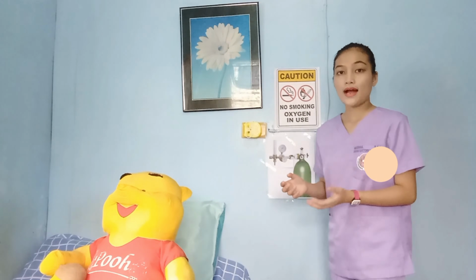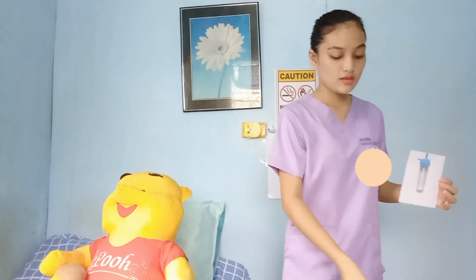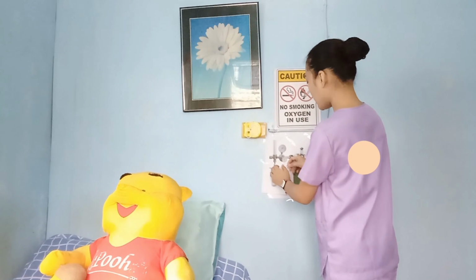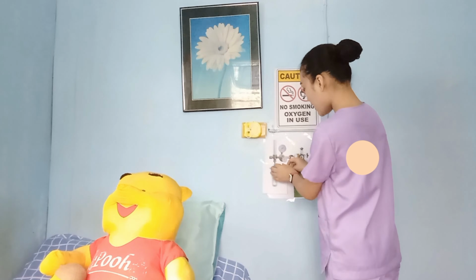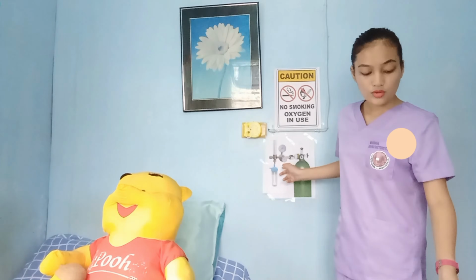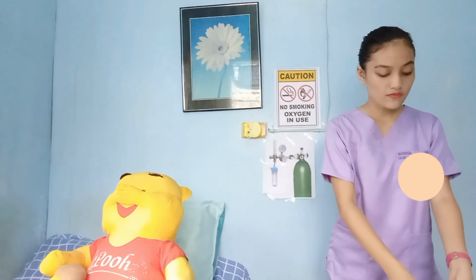If needed, we'll have to have a humidifier bottle pre-filled with distilled or sterile water, depending on agency protocols, and it should be prepared prior to coming to the patient's bedside. So this is the humidifier bottle, and this humidifier will be placed below the flow meter gauge, so that the oxygen will first pass through the water, pick up vapor, and then go through the prescribed oxygen tubing of the patient.